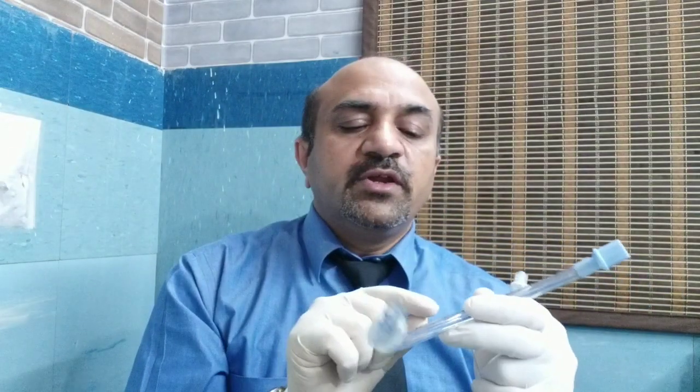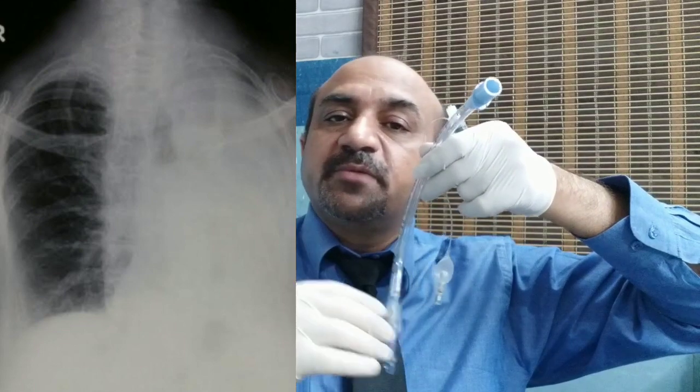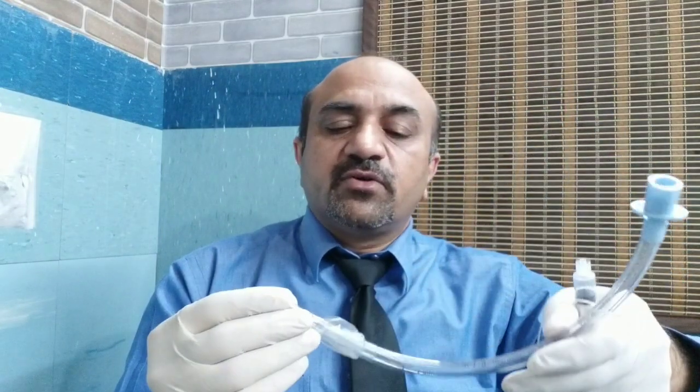So this is the endotracheal tube, which can be used orally or nasally, and obviously when we pass it through the nose, we need to pass it even further, but taking care that it doesn't go past the carina, which is the bifurcation of the trachea, because in that case it will only inflate the right side of the lungs and the left will collapse, or there will be atelectasis. So we need to check it on the X-ray and also by auscultating 5 regions, which I'll mention later on. So this is known as the endotracheal tube.